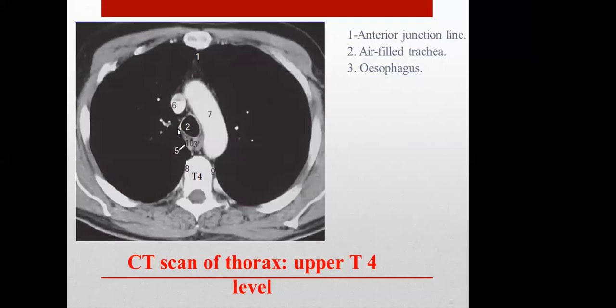Number 4 is the right paratracheal line. Number 4, right paratracheal line.